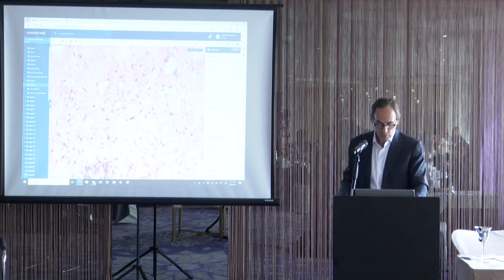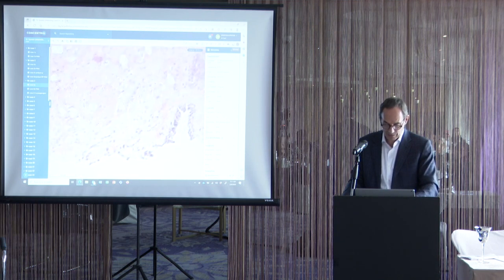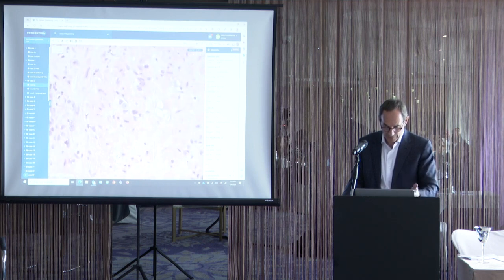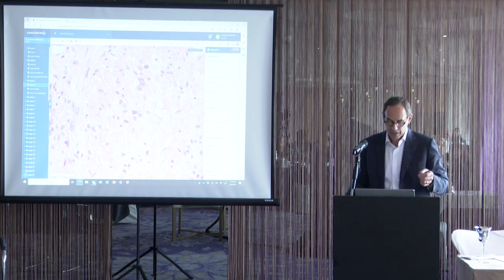And if we come over to here, these crowded clusters of glands are also not a normal pattern of benign glands. But if we were to grade this, we would grade this as pattern 4, because some of these glands are 3, but some of these look like more poorly formed glands. But, for example, in here, there are even some individual cells, some of these other cells with vacuoles, we would consider even pattern 5. But this is cancer with radiation effect.